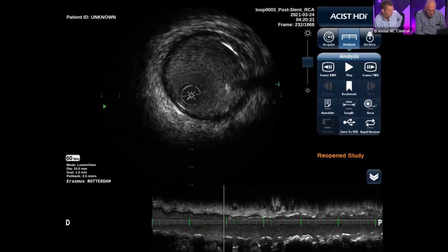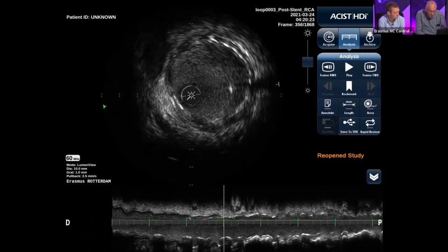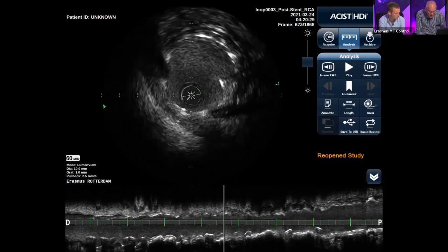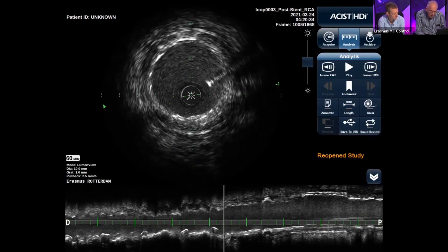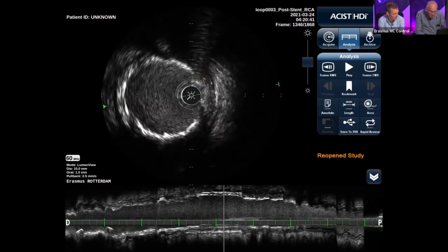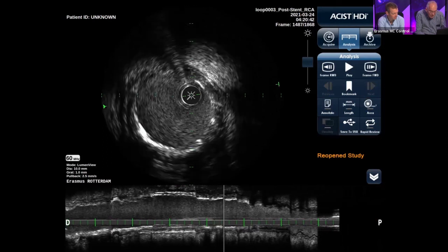So again, distal edge, we check the distal edge here. The stents, sometimes it's a bit difficult to determine your stent struts against calcium, but here they are. We go up and down, we look for disruptions. I don't see them clearly, it's more the calcium, so no visible edge dissection. So we move in here, and in the meantime, I know everyone is looking for thrombus protrusion. Actually, in the haste, we didn't see, a bit at 11 o'clock, at 12 o'clock, we saw a little bit. So we go more proximal, and then we see that we're outside the stent in here. We have the struts coming in here. Now it's without any edge dissection.